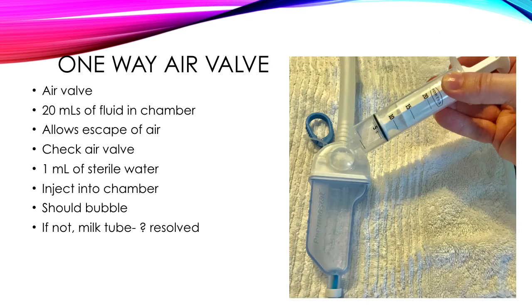One of the features you'll notice on the pneumostat is the one-way air valve. You can see there's a 20 mil chamber, and above that chamber is a small half-moon where you can add 1 mil of sterile water. This chamber acts as a reservoir with a one-way valve — air can bubble out of that reservoir, and if you have water in there, as the patient inhales and exhales you should be able to see it bubble, which is a normal sign.